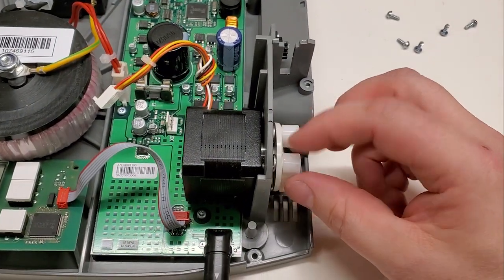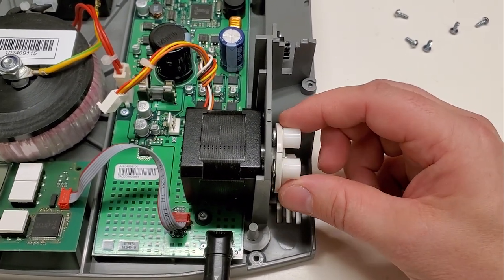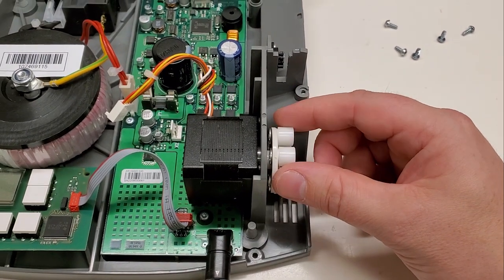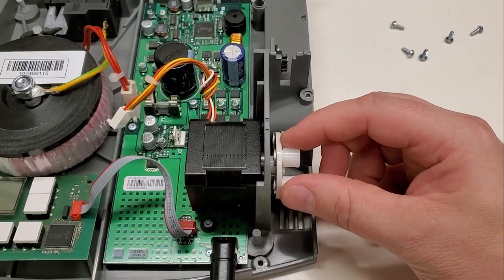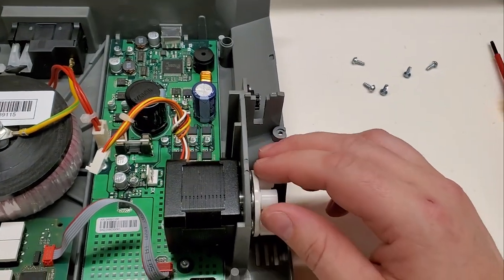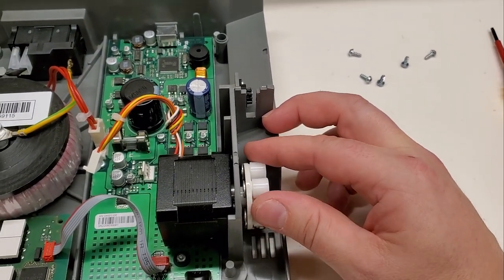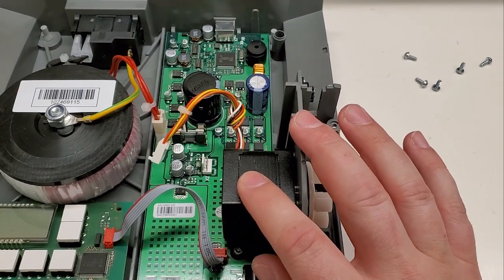And when you short them out, you should notice a dramatic increase in the resistance to spinning the motor. And I mean a very dramatic increase. Like, it'll be very tough to spin even at a really low RPM, like what you can see I'm doing right here. And if you go ahead and short out both coils, then this guy will be incredibly difficult to spin, even at a low RPM, because this guy actually generates electricity.